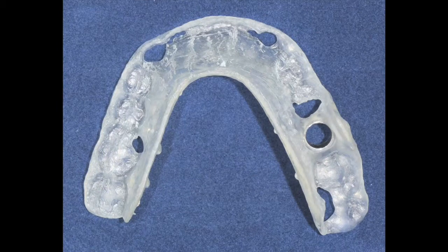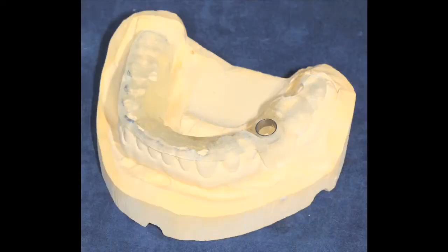Once I have approved the plan by going to my online account, the surgical template is ordered. In partially edentulous cases, the surgical template often requires adjustment. This adjustment will be handled by Glidewell Laboratories. If necessary, the flange area can be modified if it interferes with reflection of the flap.